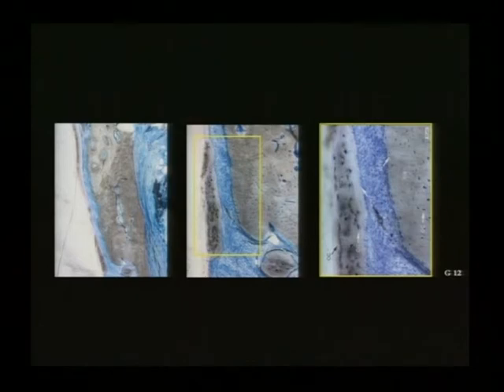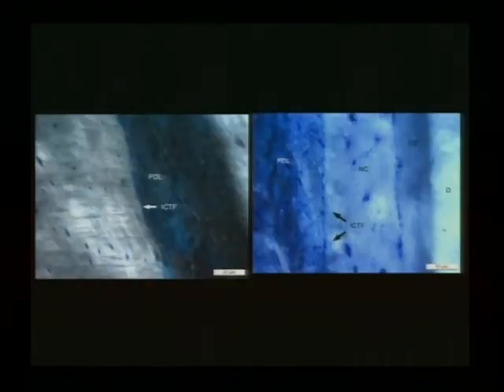If we look at this area here, we've got our bone here. This is new cellular cementum. So here, these are osteocytes, woven bone. Here's Sharpey's fibers, functionally oriented PDL, Sharpey's fibers, cementocytes, new cementum, old cementum, dentin. And in polarized light microscopy, dentin, old cementum, new cementum, Sharpey's fibers, PDL over to the bone, Sharpey's fibers, new bone. No doubt we have achieved all of the things we need to say we are getting true periodontal regeneration. And we did it every time.